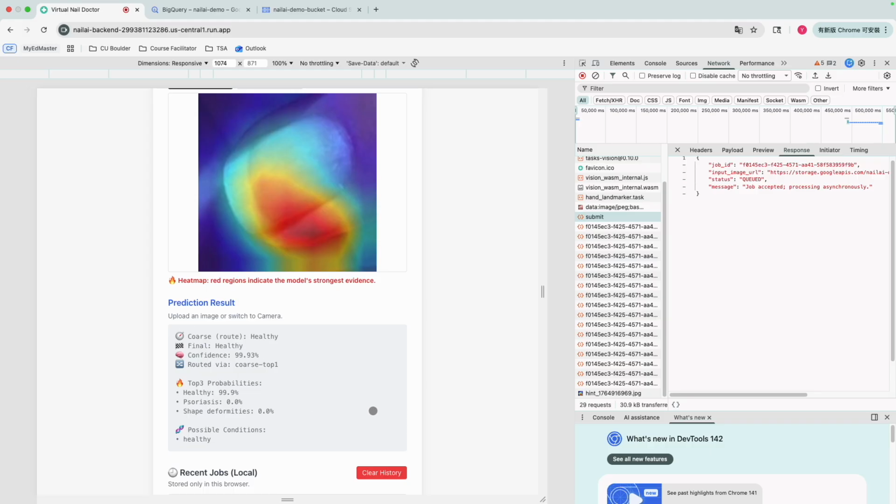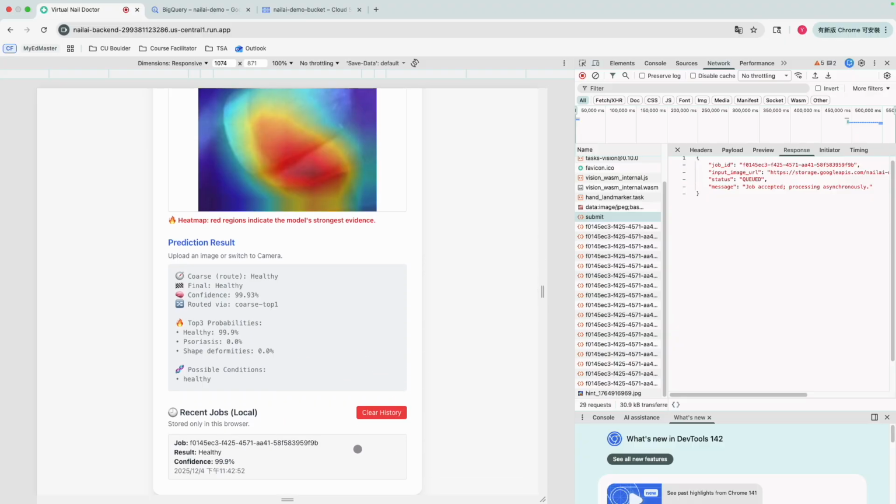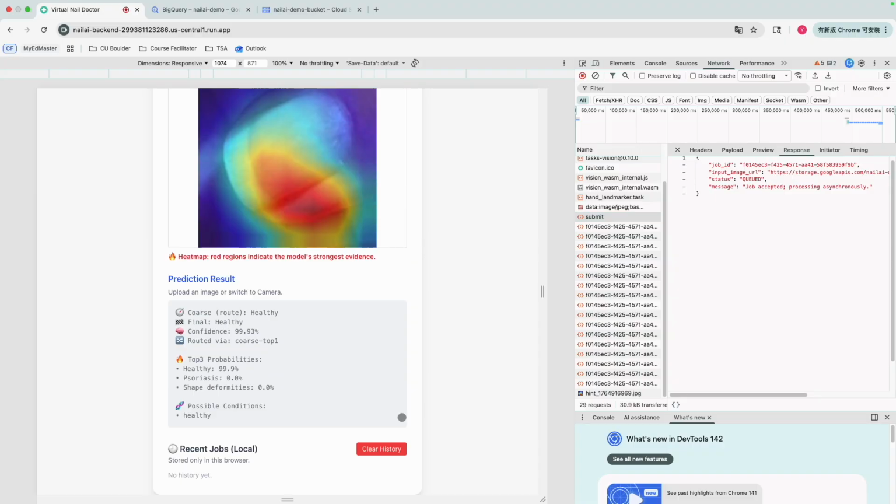Okay, everything I just showed runs fully on Cloud Run asynchronously, and it scales automatically. I also added a clear history button here, so there would not be a privacy issue, because we can clear history and there's no user data kept here.